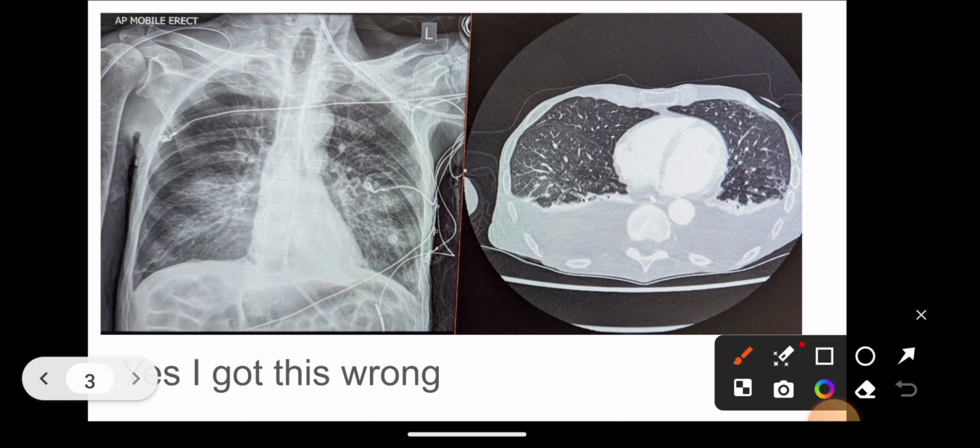This is one thing I test myself on every time I have an x-ray and a CT done on the same day. I will go through the x-ray, I will do my best to work out the anatomy, I will come up with a diagnosis only for myself, which I write down, or just, if there's nobody else around, I just say in my head. And then I test it against checking the CT and test my anatomy.